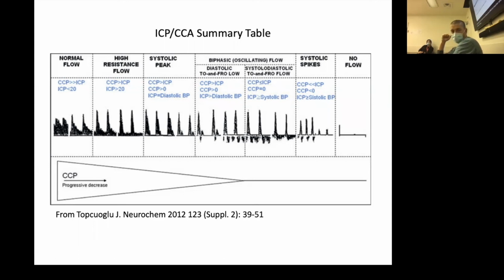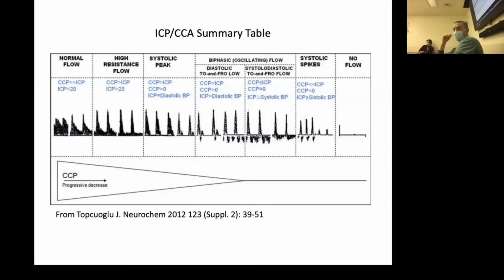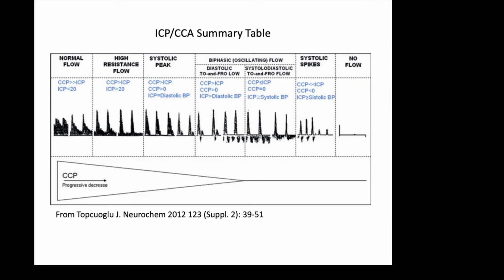Any questions online? Dustin, I have one. Great job. Do you use transcranial Doppler at the bedside in the neuro ICU to assess whether or not your patient has intact cerebral autoregulation dynamically? That is a good question, and you definitely can do that. I avoided that topic because it is a little bit hairy, but you can absolutely do that, yes. And can I just ask, I know it's a tough one to cover, but what's your approach to assessing that at the bedside?